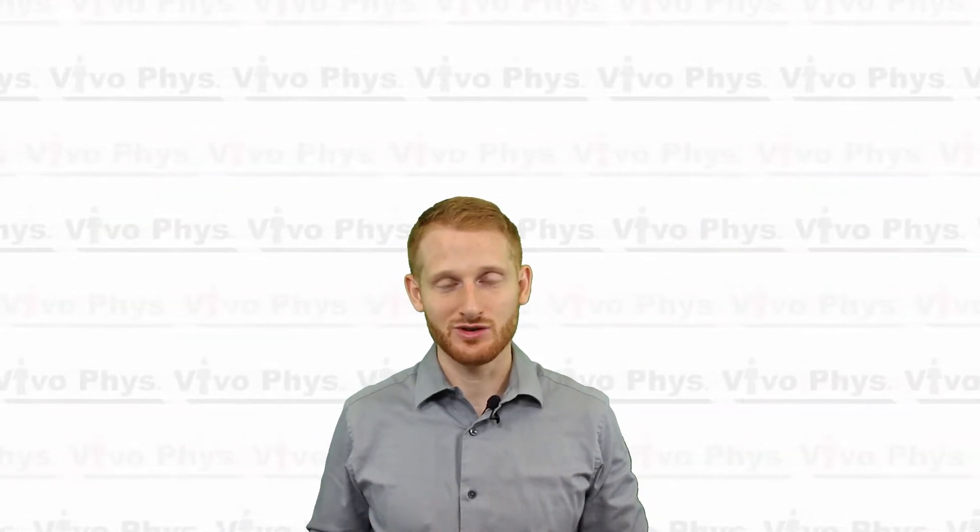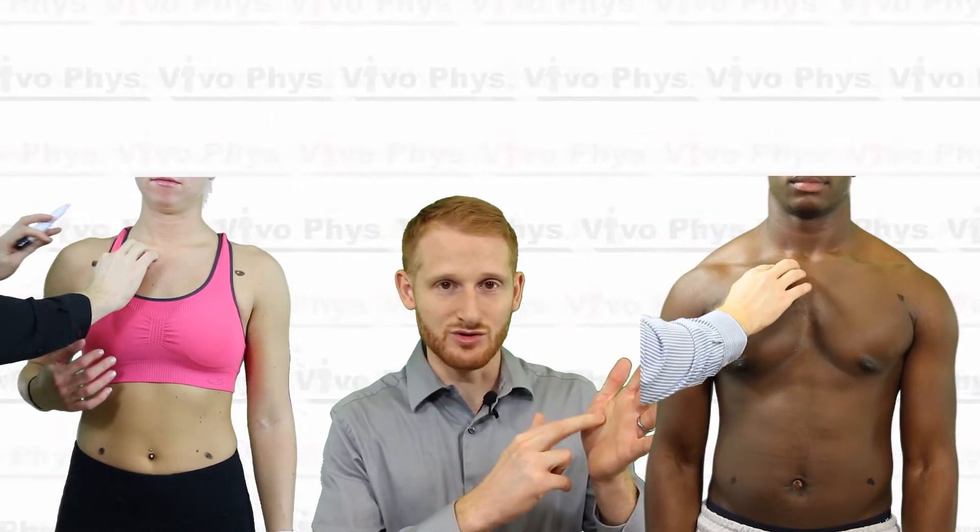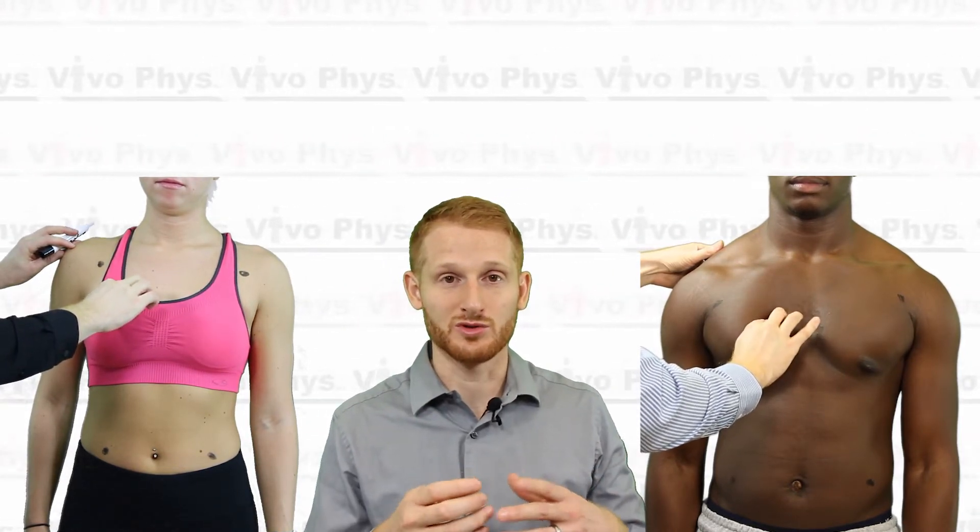The next six electrodes are called the V leads — V1 through V6. Starting with V1, you're going to feel for the ribs in the chest on the right side of the participant. I put my fingers just below the clavicle on the right side and do a walking motion. The reason for this walking motion is you can feel each time you press down whether there's soft tissue or hard tissue underneath your fingers. Hard tissue means there's a bone; soft tissue means you're between bones. What you're looking for is the space between bones, because electricity doesn't travel through bones nearly as well as it does between those spaces.